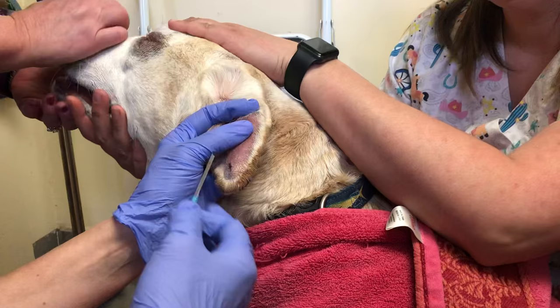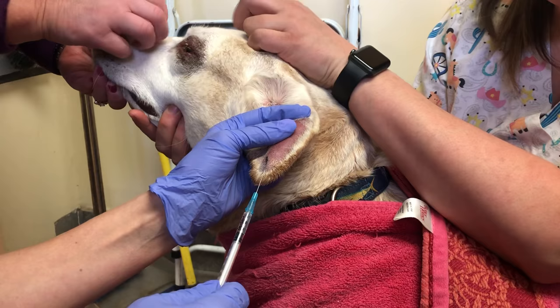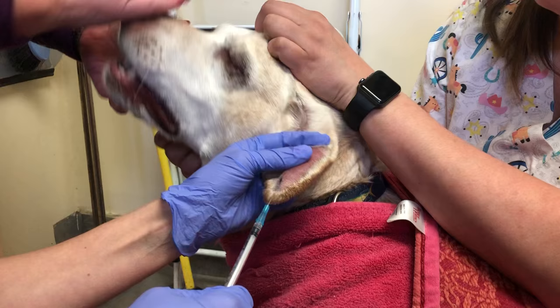We have shaved and then alcoholed the inside of her ear. I made a little spot where the teat cannula is going to go. This is lidocaine — a numbing agent. I put it in the skin and infuse it as I come out. It will take just a little while to work, but will help numb the area as I'm putting her sutures in.